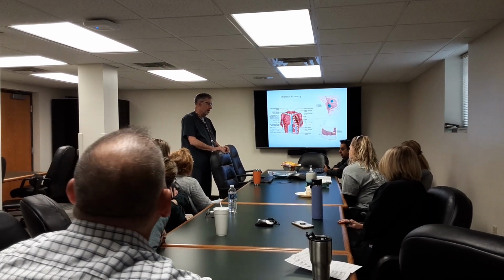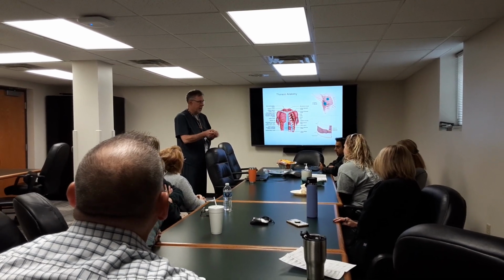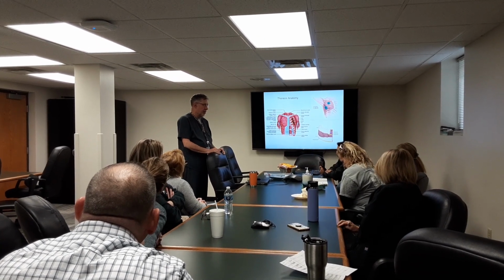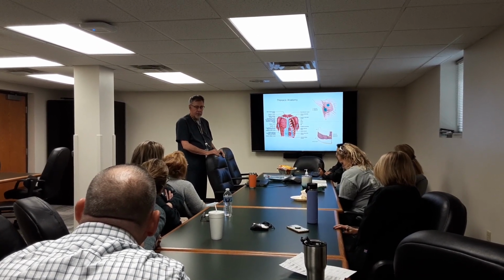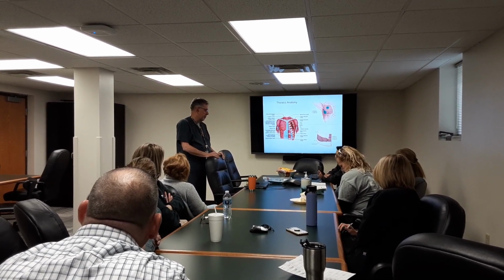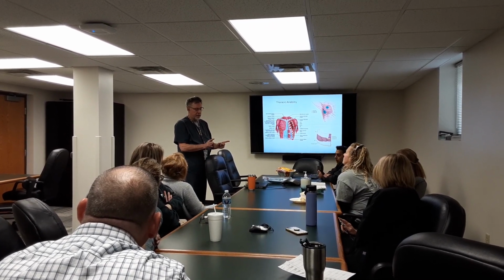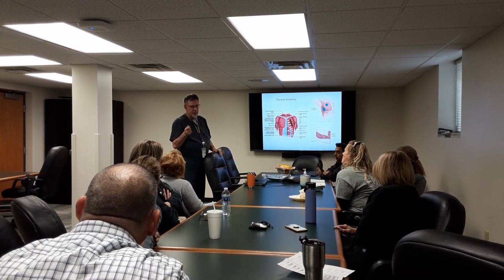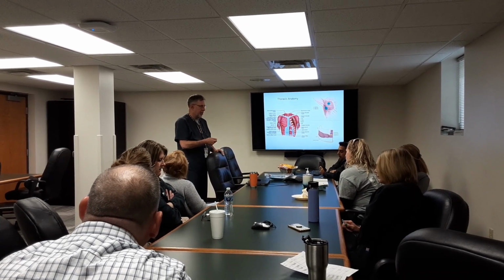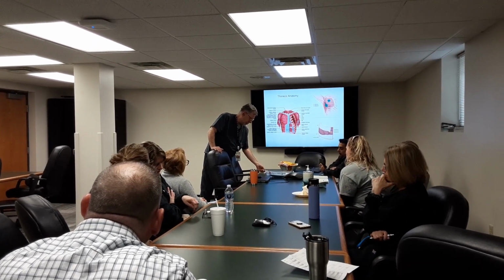Typically, I'd always have help doing this. I wouldn't do it alone. I don't like doing anything alone, but anyway. Because you can have people hand you stuff, and you've got one hand that's out of commission, hopefully your non-dominant hand, holding that needle in place until you get the wire. When the wire comes, the needle comes out over the wire. The mistake I've seen is they don't get the wire in far enough. They'll put the wire in and think, oh, it's in that far. Well, that's from the top of the needle, plus the reducer sheath. So you've got to put the wire in pretty far. Then you may have to pull it back a little bit because you don't want to go so far that you get past the point where you can control the wire.